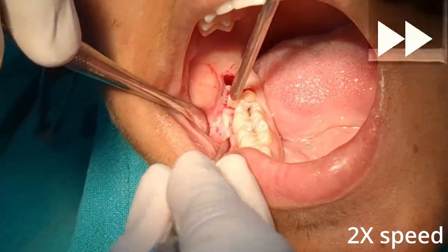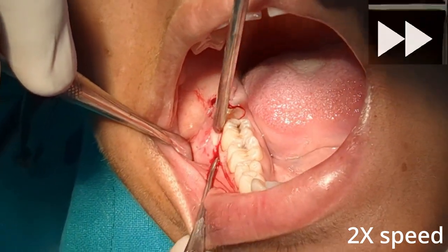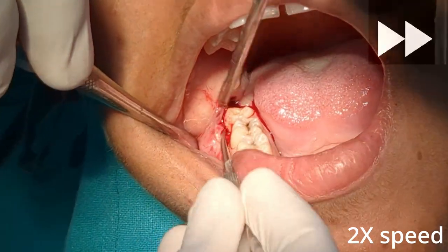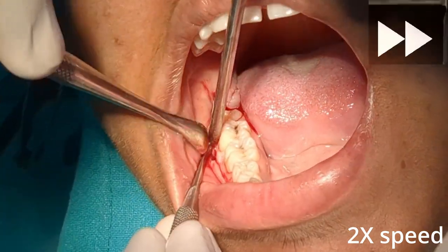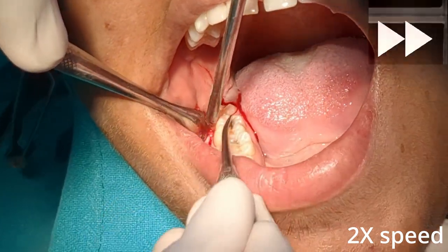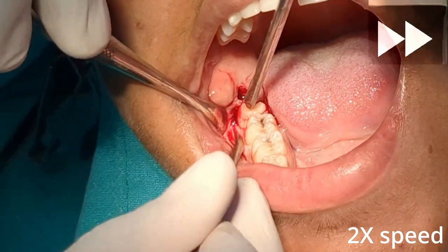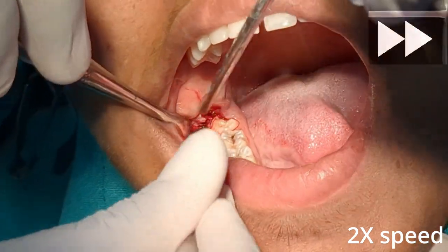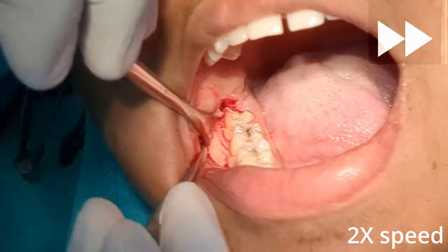I start the reflection of the flap from the anterior releasing incision. I then reflect the flap, making sure that I don't tear the periosteum.